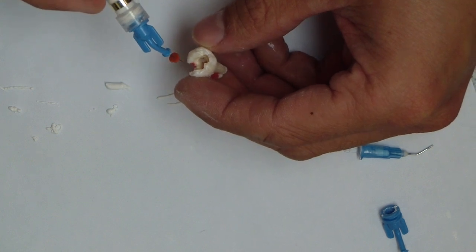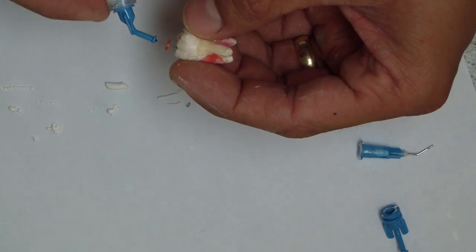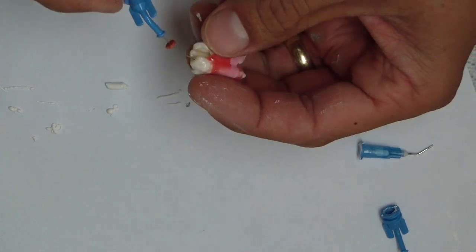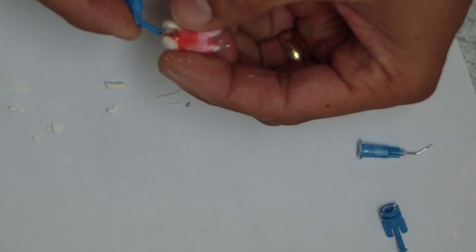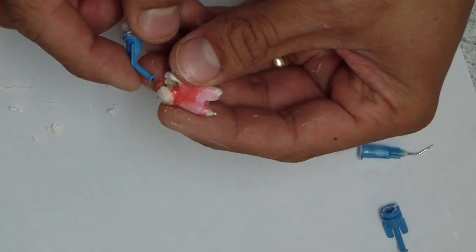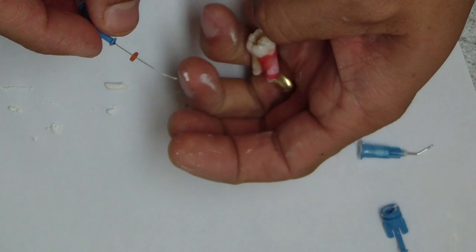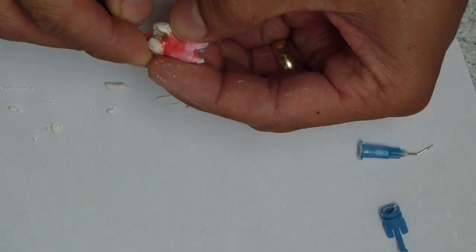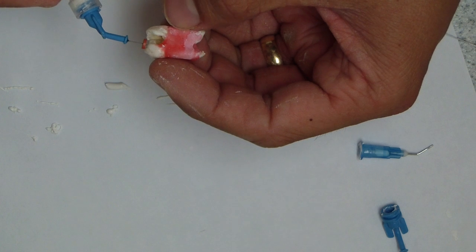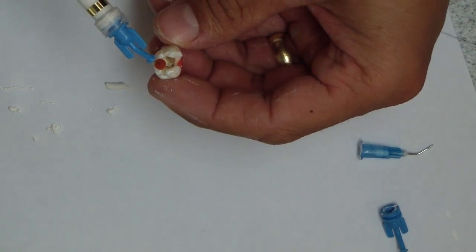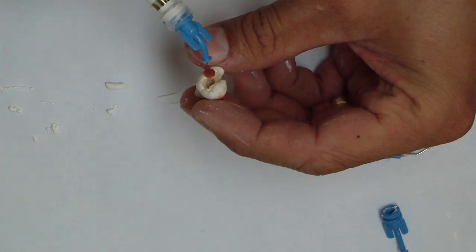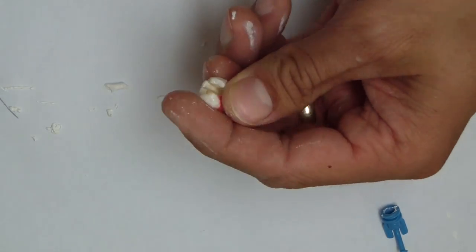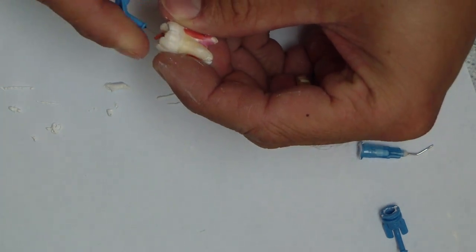Let's go with the mesial buccal canal. One thing to watch—it's a small canal, and these tips are flexible, bendable. Let's place it in there, and you can see it extrude out the end. That's an important point: you need to make sure you're not going to extrude beyond your apex. Let's do it tabletop style—pull back two millimeters from there, then extrude. We'll show you from the coronal portion what it looks like.